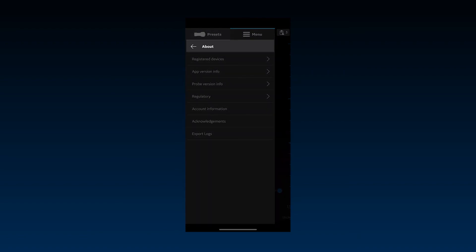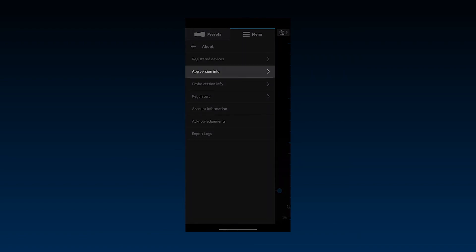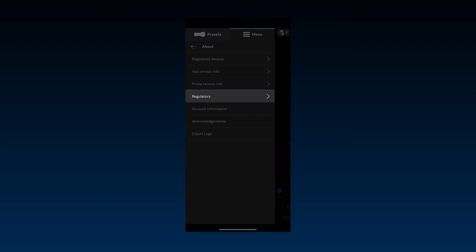Under the About section, you'll find information about your registered devices, app and probe versions, as well as regulatory labels.